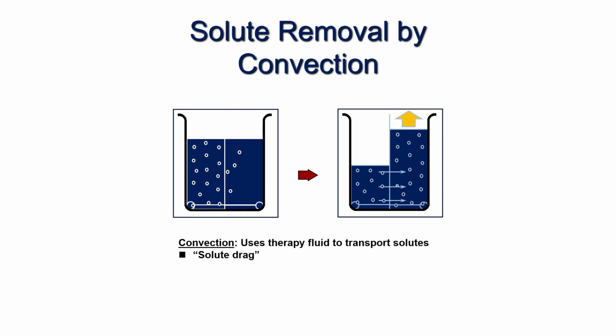So these heavier molecules adhere to the filter, and then they'll clear out in the effluent. But the adherence to the filter can actually clog the machine more quickly, which is why you will see more clogging in CVVH of that filter. Your effluent pressure will be much higher. So it's kind of the expectation when using things like rhabdo in really septic patients, because you're pulling out the myoglobin in rhabdo, and in septic patients, you're pulling out those microclots. So you're going to have higher effluent pressures. So you probably need to change the cartridge more frequently in those types of patients.